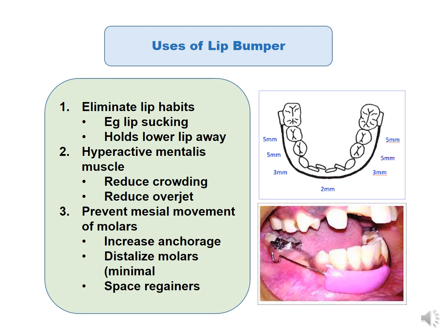Now, since it's attached to the lower molars, it prevents mesial movement of the molars, which can increase the anchorage value of the molars. It can also be used to distalize molars, although the effect is usually minimal, and it can also be used as a space regainer.